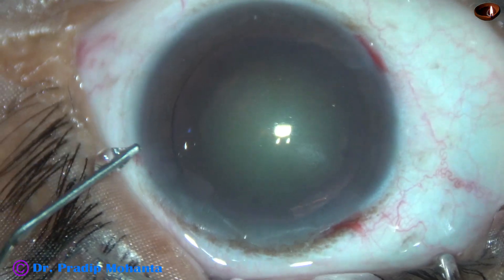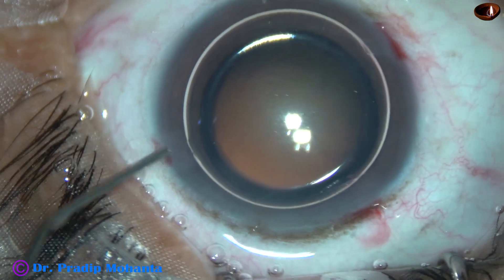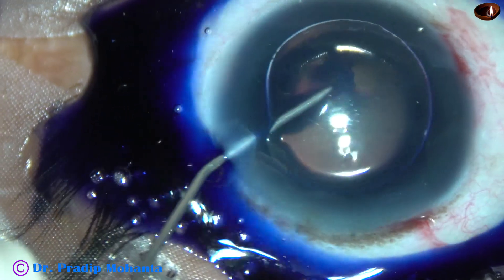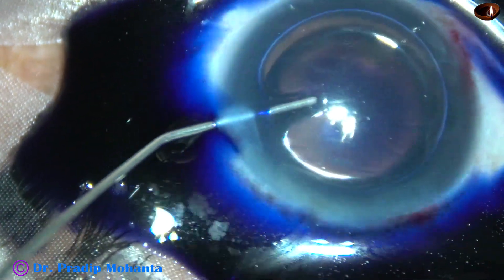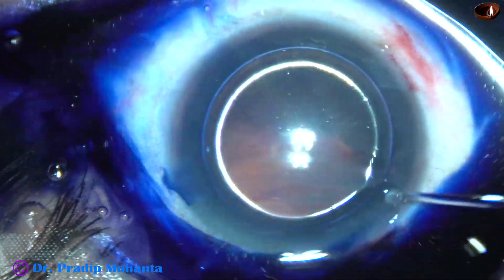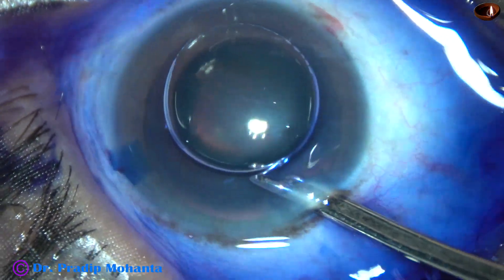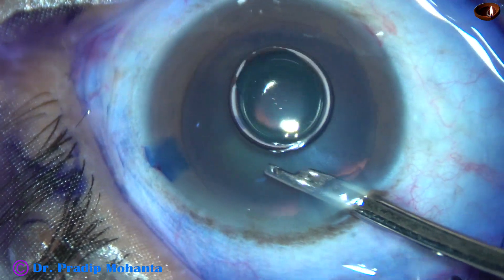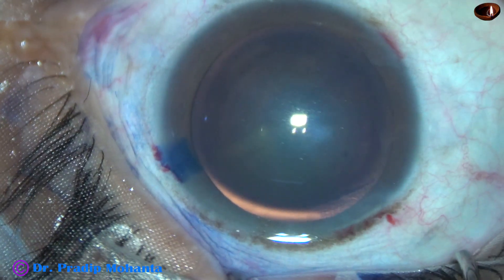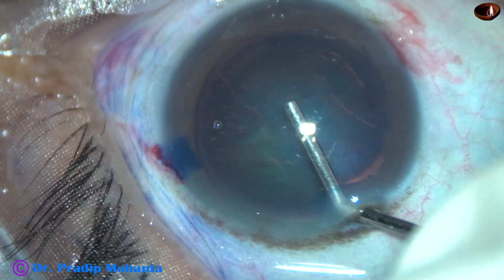My plan is to use bi-manual irrigation aspiration in this case. Now, to demonstrate capsulorhexis clearly, I am going to use trypan blue dye in this case. Otherwise, we can do the rhexis without using dye. I usually wash the dye out — BSS is used to wash the dye out.